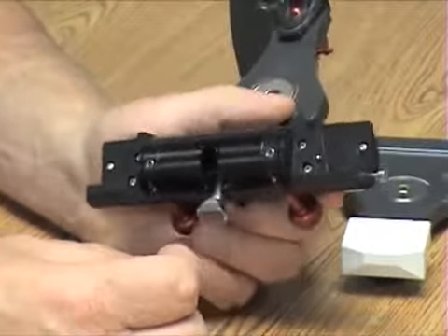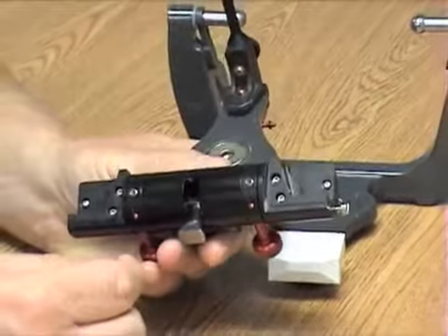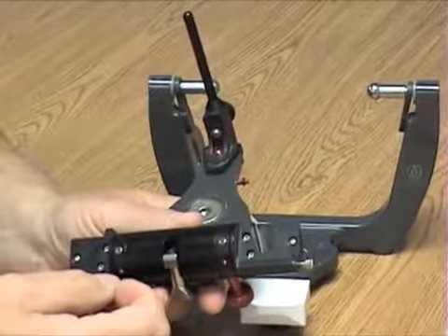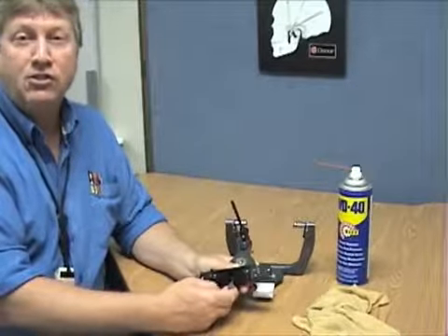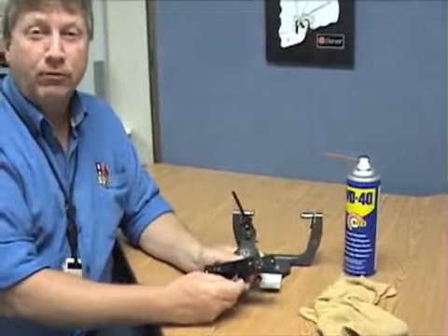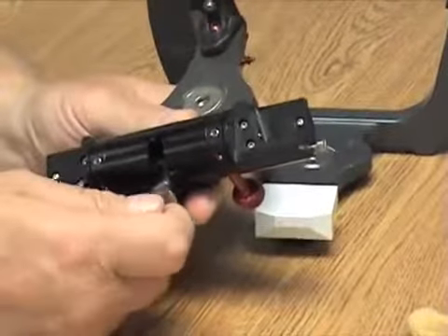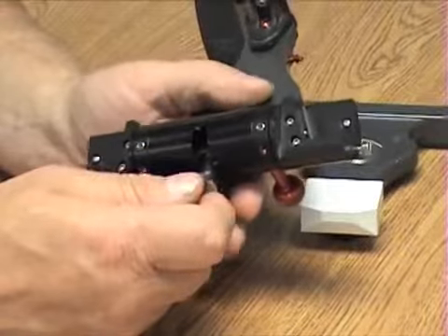People will ask me, how often should I lube the articulator? A very simple answer is that when you buy the articulator and you're going through the functions and looking at all the neat gadgets it has, you're going to play with that latch a little bit. You're going to see how it latches and unlatches, and you get a pretty good feel of how it should feel from the factory. Once you start using it and you feel that the latch is starting to drag a little bit or feels a little catchy, that's probably the best time to go in and lube it.